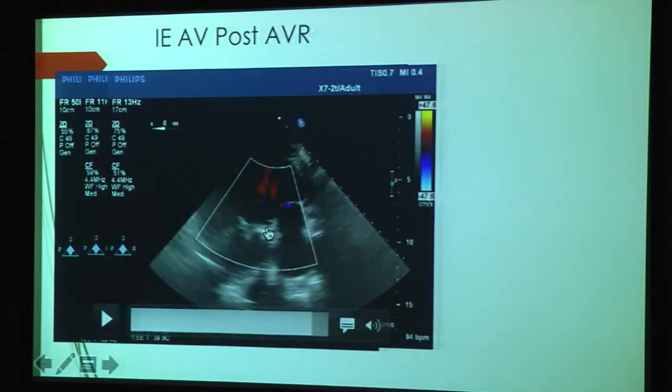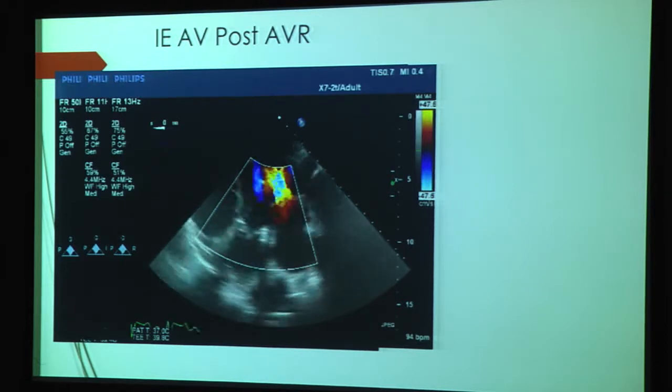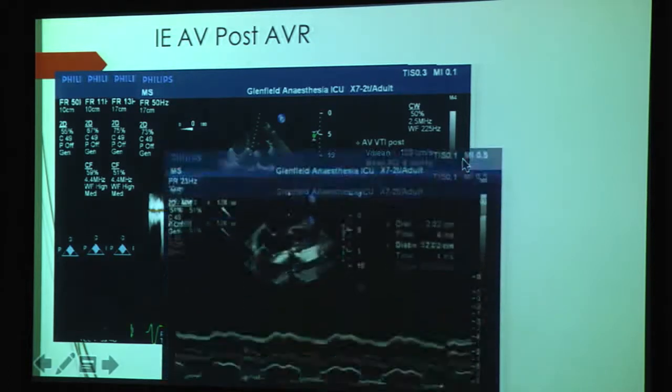and you can see that the perforation in the mitral valve has disappeared. We go deep transgastric, another look at regurgitation as you're now in line with the flow as compared to perpendicular. You get a better idea. Again, there is no regurgitation, and we take a gradient, and the mean gradient is 8 millimeters of mercury, which is perfect.